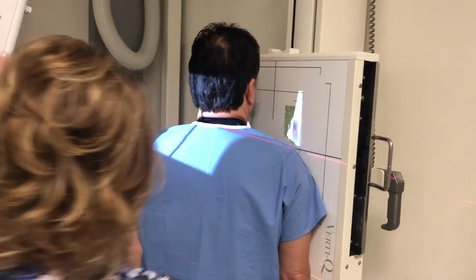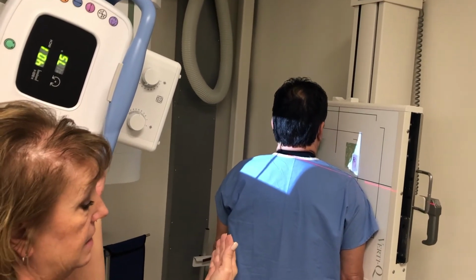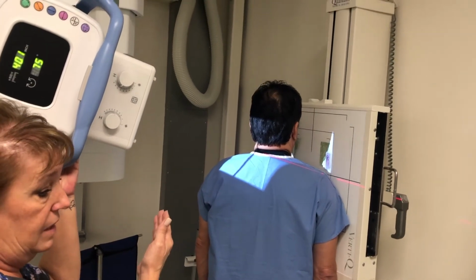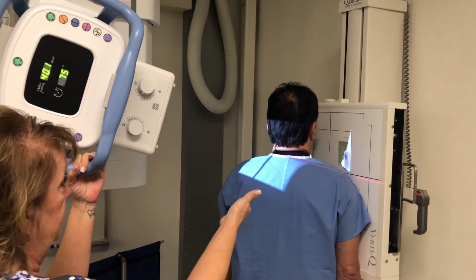I have a 15-degree caudal angle. Now normally if the patient was on the table, I would adjust my SID because of this, but most upright wall buckies are detented at 40 and 72, and they don't allow you to adjust your SID after that. So I'm going to keep this at 40, angle 15 caudad.